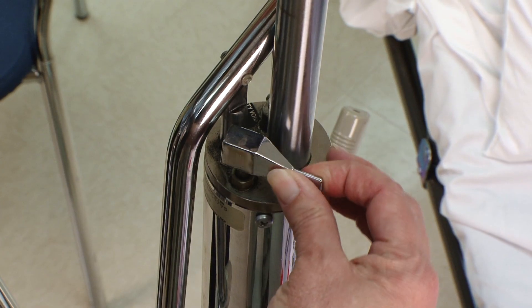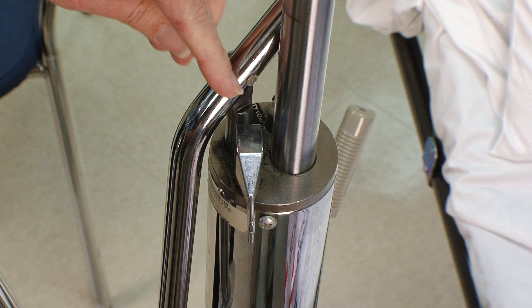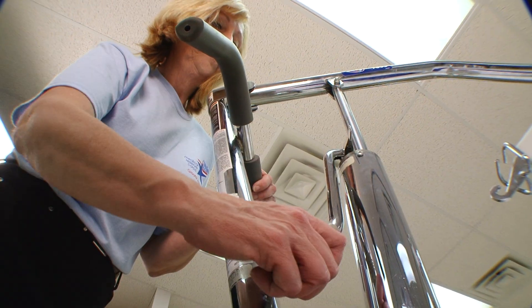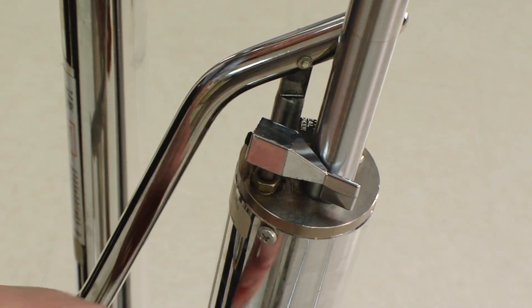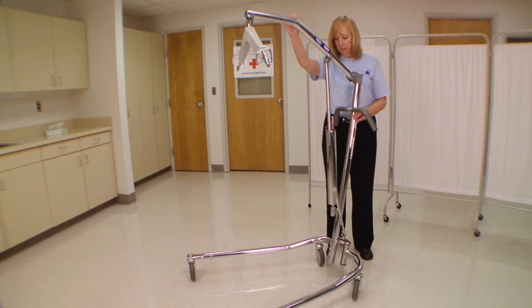The valve located at the bottom of the pump needs to be turned to the right, or clockwise, in order to create a seal. Once you have turned it to the right, take the handle and pump up and down to raise the cradle. When you are ready to lower the cradle, simply turn the valve to the left or counterclockwise — this needs to be done slowly so that it does not drop too quickly.